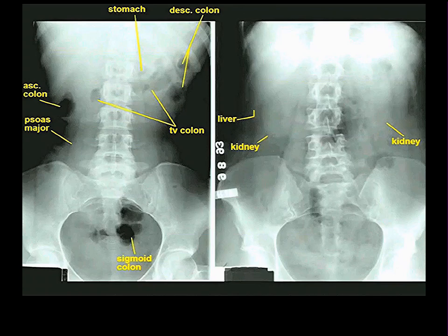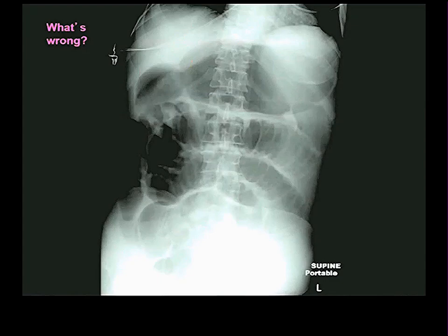On this one, which has less air in the bowel, and there's this air right here, maybe I don't even know what those things are. You can see, again, because the kidney is surrounded in people by fat called perirenal fat, you can often see the margins of a kidney right here. That's the margins of the right kidney, more subtly, the margin of the left kidney. And here's something which might be the inferiormost point on the liver. Bottom line is you don't see much. And therefore, plain films of the abdomen are really only done to spot something like this.